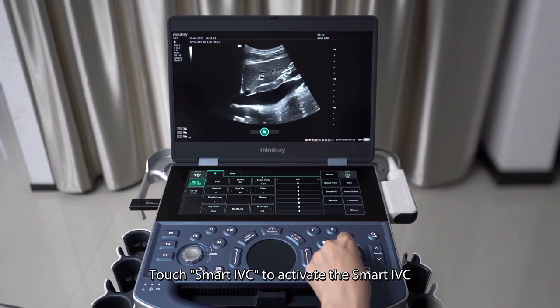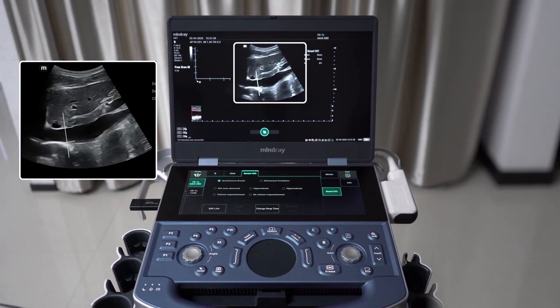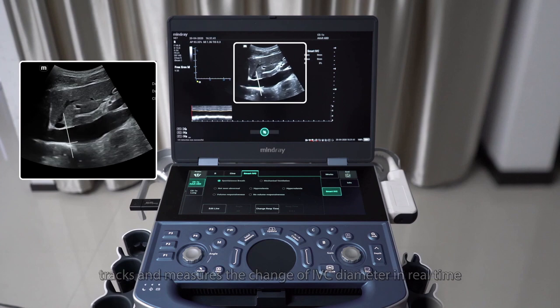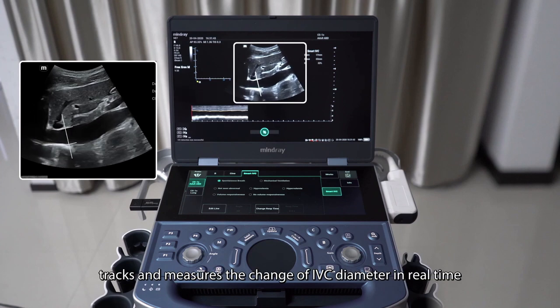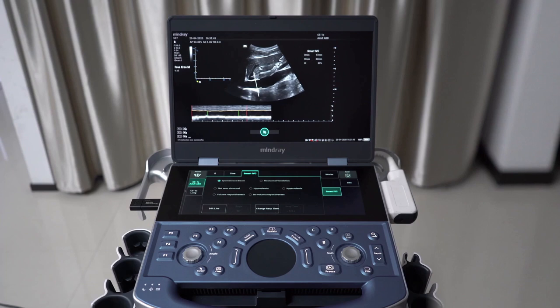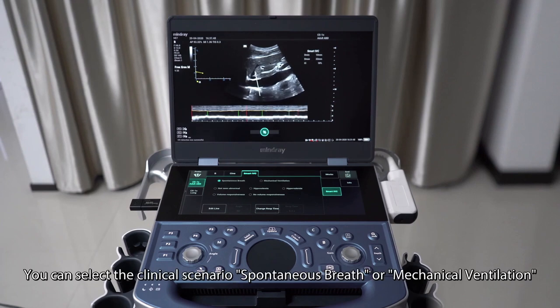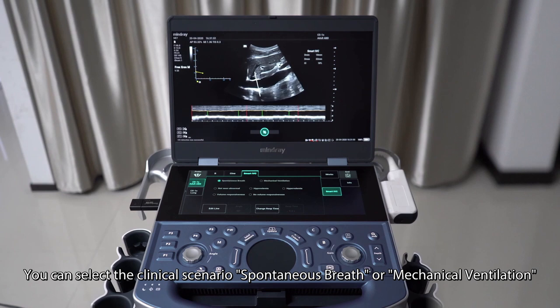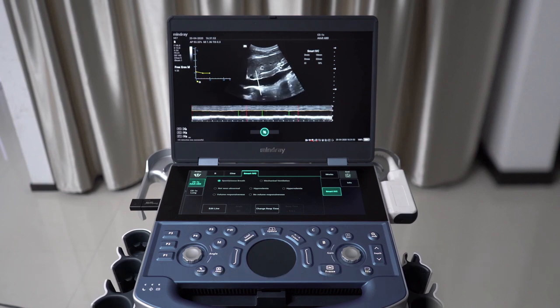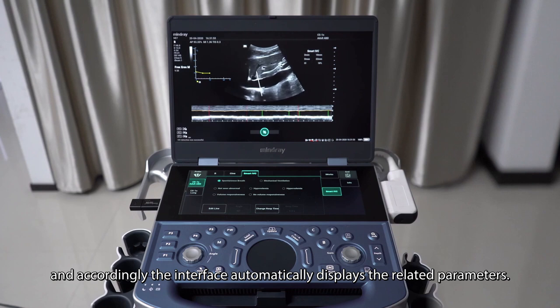Touch Smart IVC to activate the Smart IVC. The system automatically locates the IVC target area, tracks and measures the change of IVC diameter in real-time. It is important to note that you can select the clinical scenario — spontaneous breath or mechanical ventilation — and accordingly the interface automatically displays the related parameters.